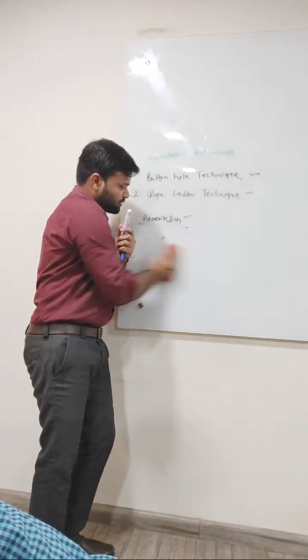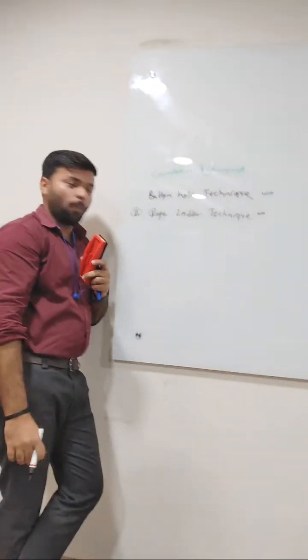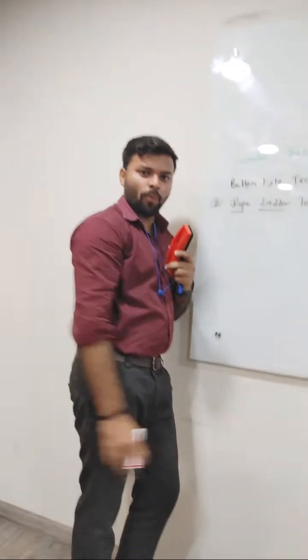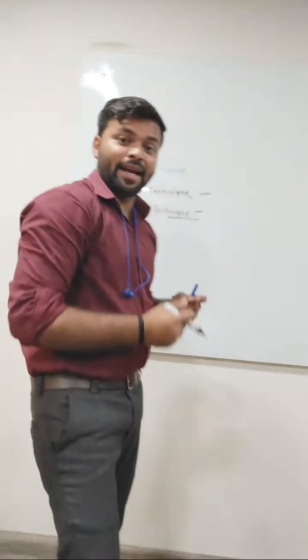The second one is the rope ladder technique. What is the rope ladder technique? It means during dialysis, every time we have to change the cannulation point.